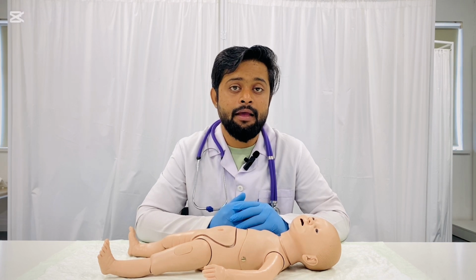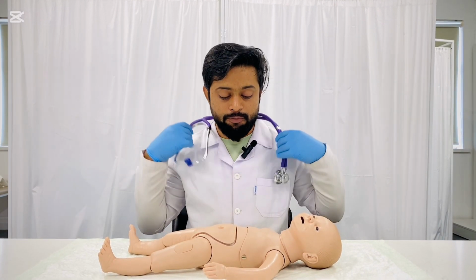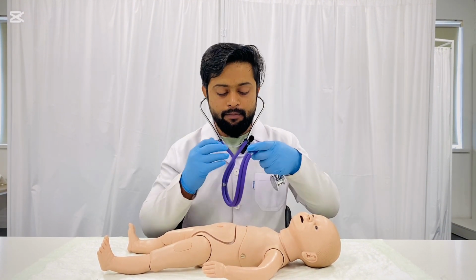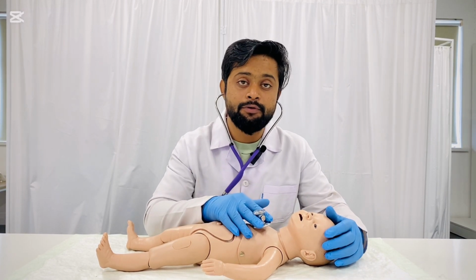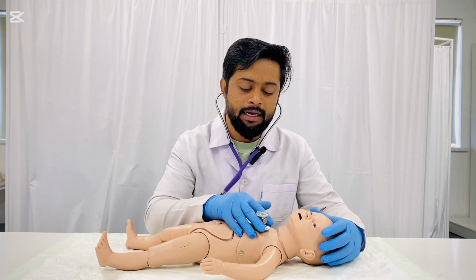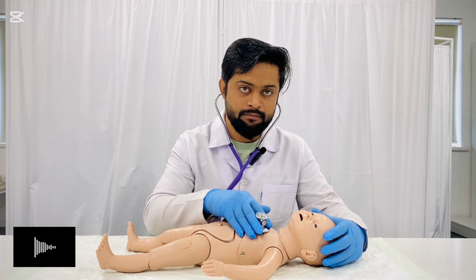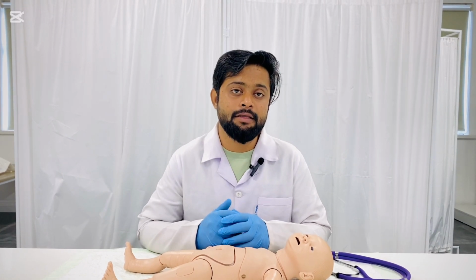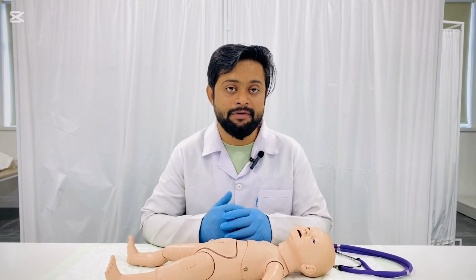In order to listen to the sounds of S1 and S2 of the heart, we use the stethoscope and put it on the third to fourth intercostal space of the child and listen to the sound of the heart. Listening to the heart needs a lot of practice, but the most important thing is that we have to find out the abnormalities, which bring the attention of the examiner for further investigation.